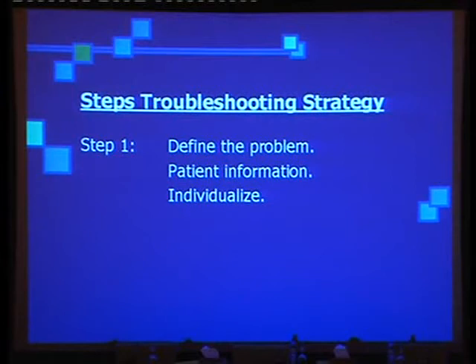Say, for example, this patient has complete heart block. I look in the chart of the patient and see what the underlying rhythm is. It is complete heart block, the rate was 40, 50, 60. This is very important to me. So what is the diagnosis? Why did this implantation occur from the beginning? Is the patient complete heart block as such, sick sinus syndrome, sinus node dysfunction? All of this interpretation is completely different.